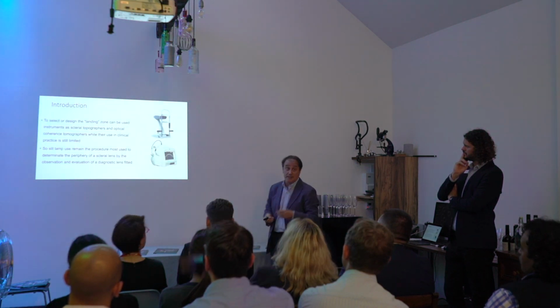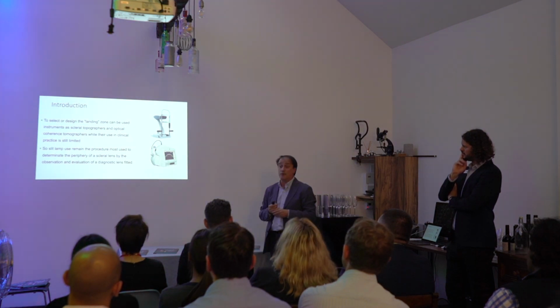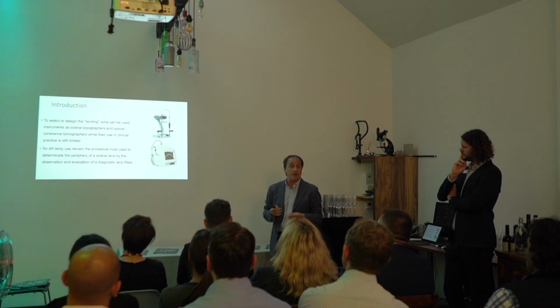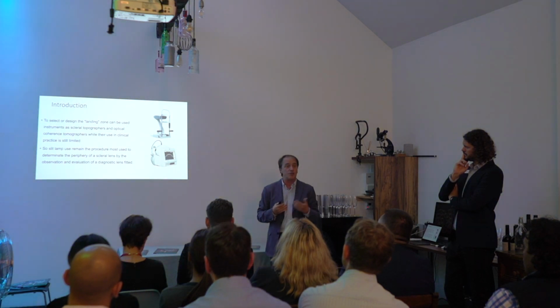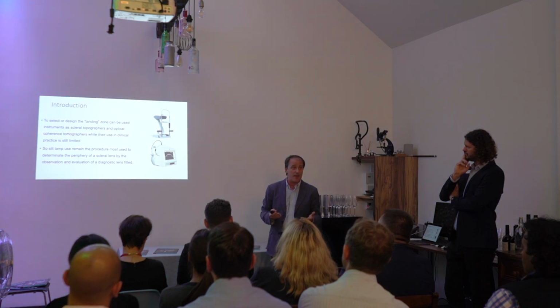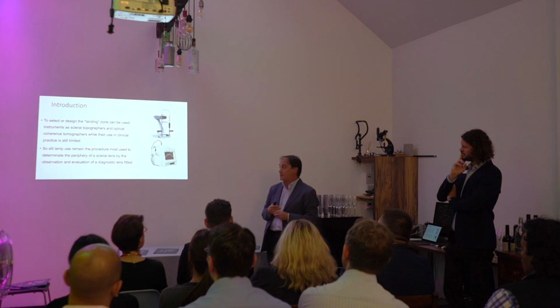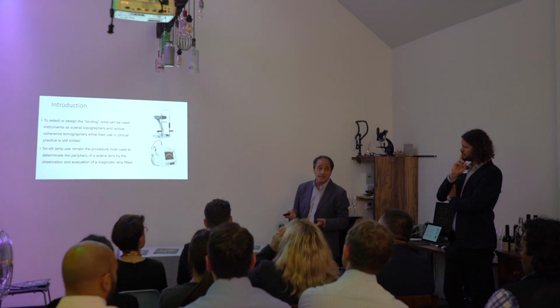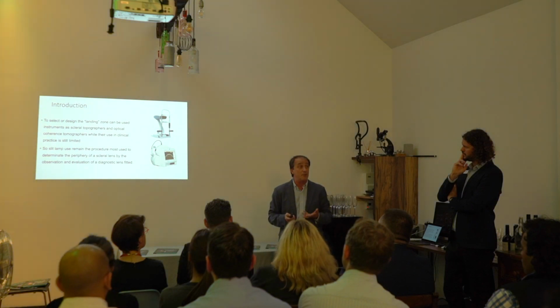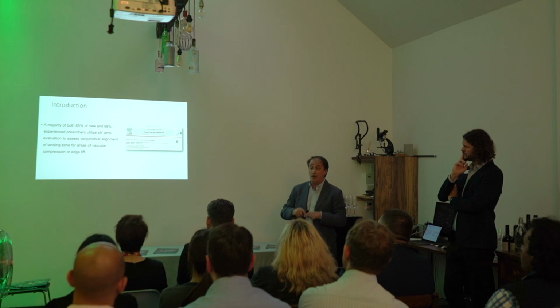So, we have instruments, Brian has the ESP instrument, or it's possible to have more information using some OCT devices, but these instruments are not so widely introduced in clinical practice and are not very cheap to put inside the practice. And so normally the slit lamp is still the instrument most used in clinical practice to evaluate the behavior of the scleral part.